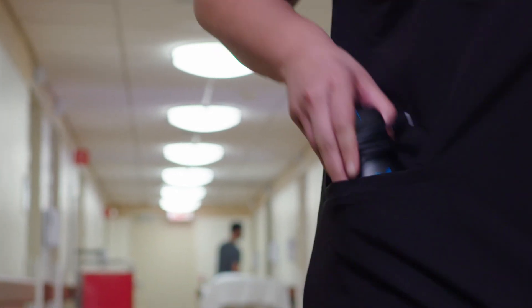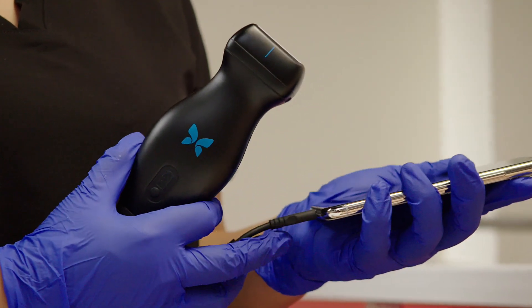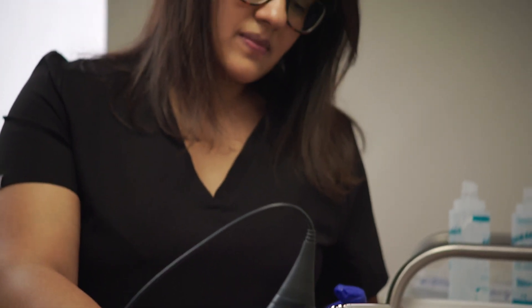Imagine a world where an entire ultrasound system fits in your pocket. This is the Butterfly IQ — the world's first handheld whole-body ultrasound system that plugs into your phone or tablet.